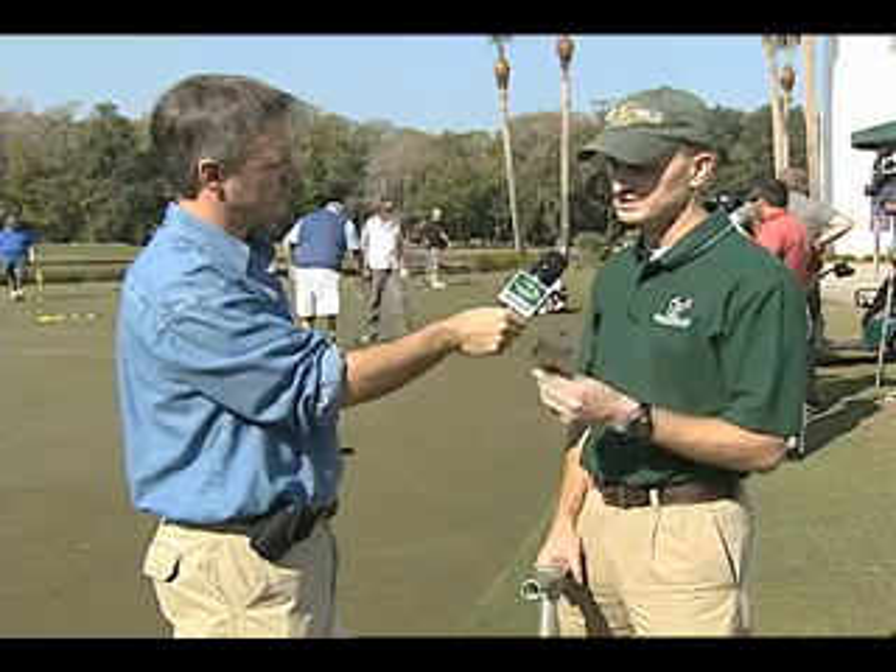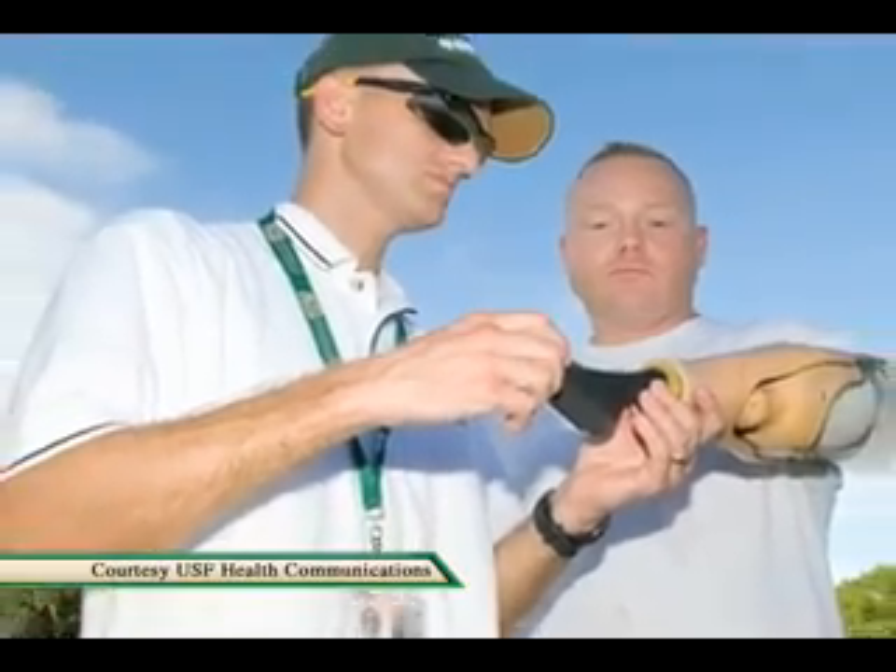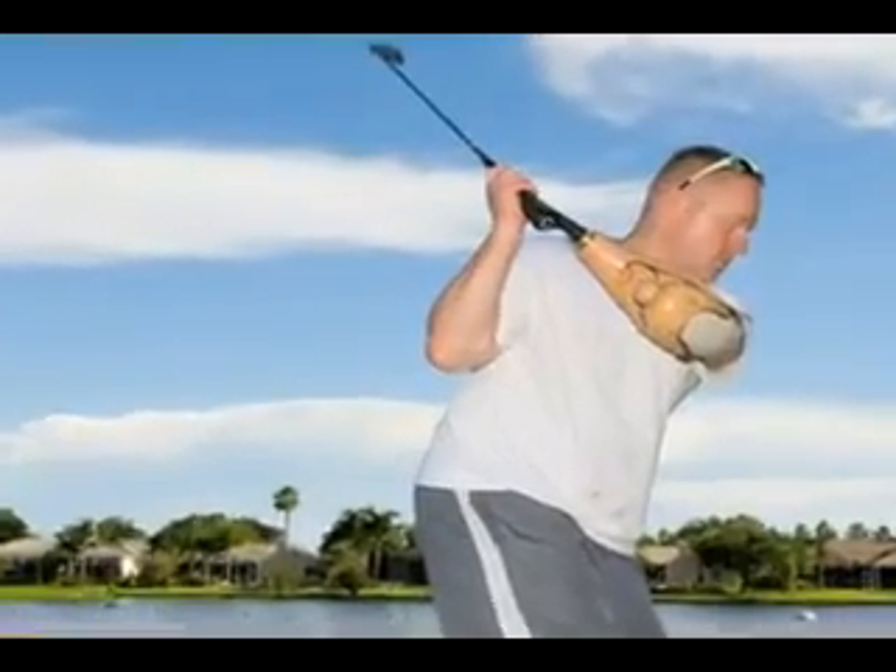We looked at two hand devices — this was one of them — to see which of the two maximizes club head speed, which you could assume then would increase ball speed.